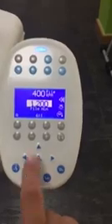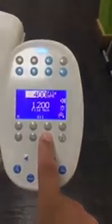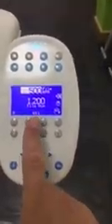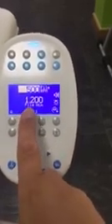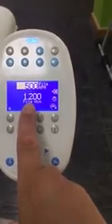So let's say we want 1.2 Newton centimetres of torque, and then I can go up to the speed setting at the top, which is measured in RPM, and let's say we wanted that at 500 RPM. So what we have here is the file moving at 500 RPM, looking for a maximum torque of 1.2 Newton centimetres of torque, and that's with a 6:1 speed reducing handpiece.